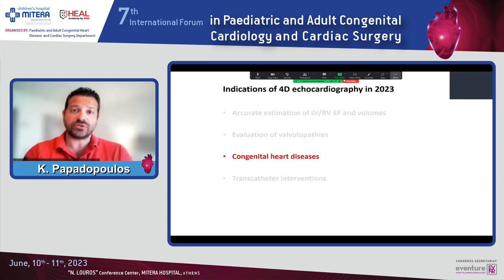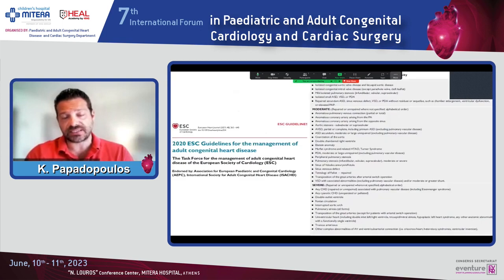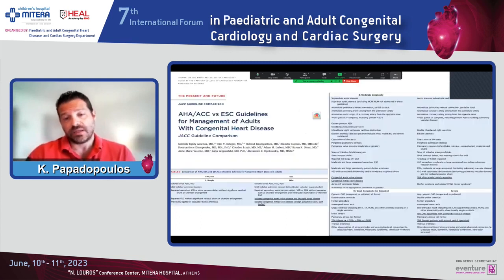In this presentation, we are going to focus on congenital heart diseases, and we know from the guidelines that we have simple congenital heart diseases, moderate complexity and severe complexity. But we know that from all this spectrum of congenitals, when we use echocardiography, and especially 3D echocardiography, we have to focus only on the simple lesions.